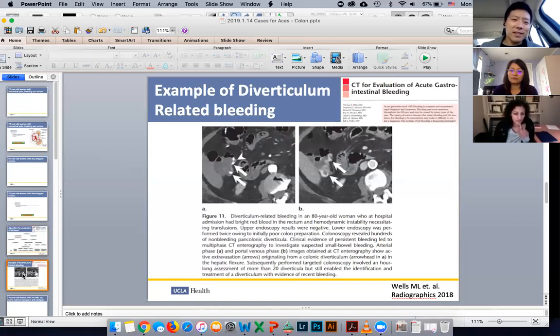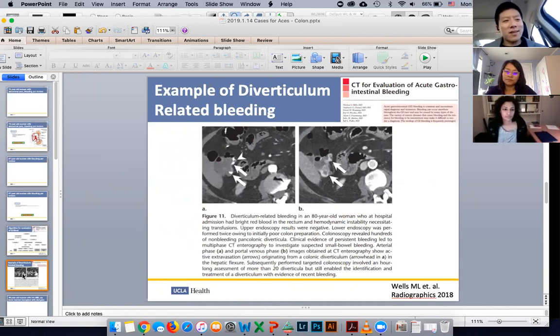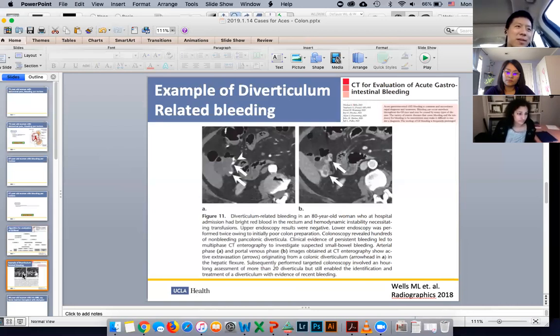The one advantage for the GI bleeding study is that they can do it over a longer period. So every time the patient bleeds, they can bring them right down. So you could do it over 24 hours, as opposed to multiple CTs. But the CT can localize the location much better. Exactly. And part of it may be bias as being a radiologist, but I think we could see a lot more with the CT scan. And it's actually an easier procedure to do than the nuclear study. So overall, I would never recommend a nuclear medicine study, even if the data in the past has shown somewhat higher sensitivity. We need some more newer cohorts to decisively determine that it's true.